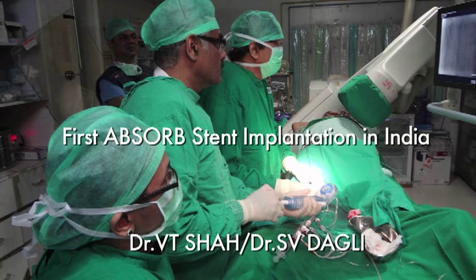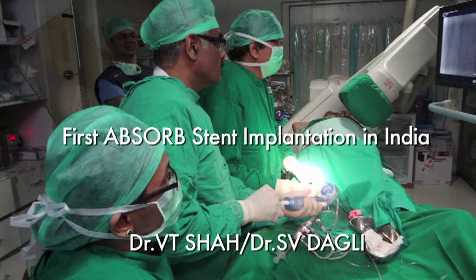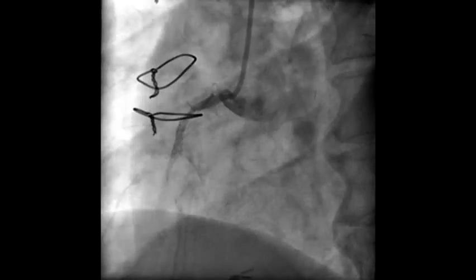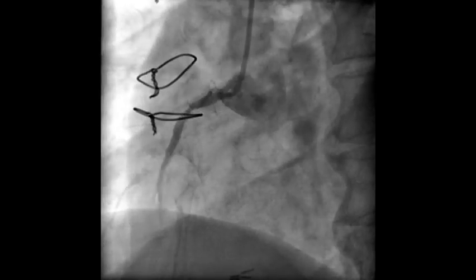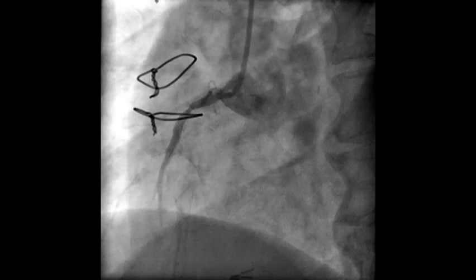I am presenting the first landmark and historic case in India of deployment of commercially available absorb stents. This is not only the first absorb stents deployed, but uniquely, four absorb stents were deployed in this patient. In brief, this patient is a 71-year-old post-CABG patient whose grafts to the RCA and circumflex have closed down.